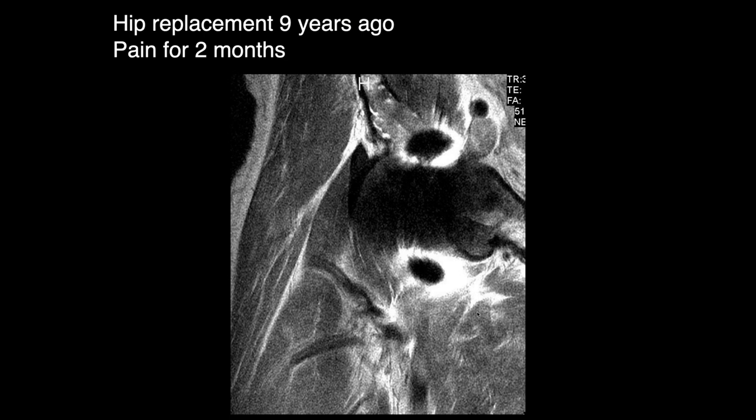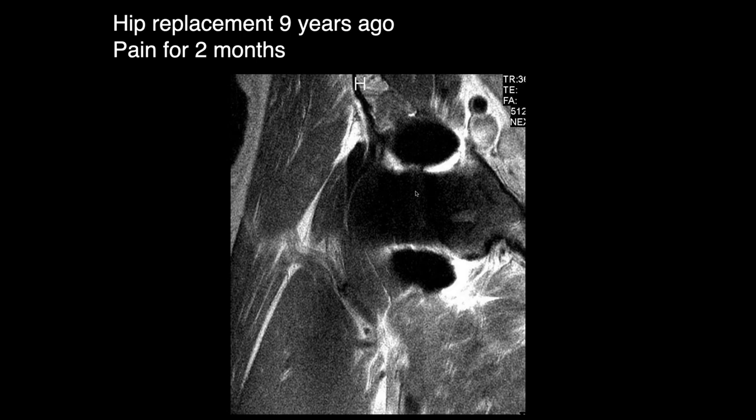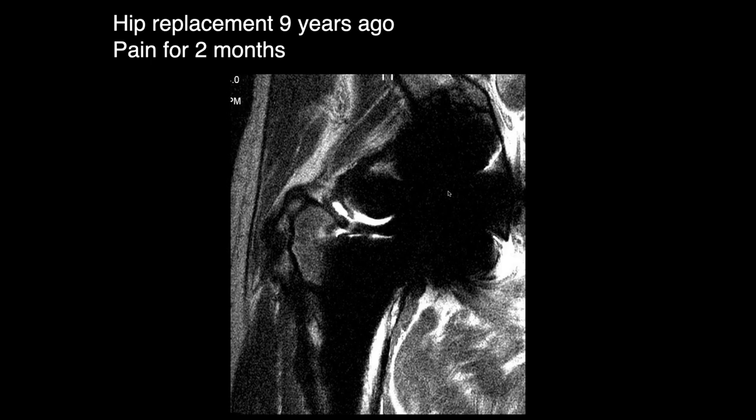Okay, so hip replacement 9 years ago, pain for 2 months. We see a few focal areas of really low signal intensity, which I'm wondering if it's metallic artifact in general. As we keep going, you've got multiple areas of metallic artifact, and I don't know if that's just poor reduction or if there's actually something like metallosis. I think this is all just metal artifact from the prosthesis.